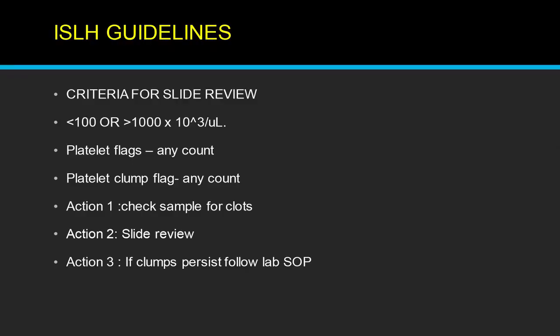If the platelet count is less than 1 lakh, if it is more than 10 lakhs, or if you see any of the platelet flags or platelet clumping flags, you must do a smear review. I just wanted to show a case to differentiate where optical platelet is better than an impedance one.